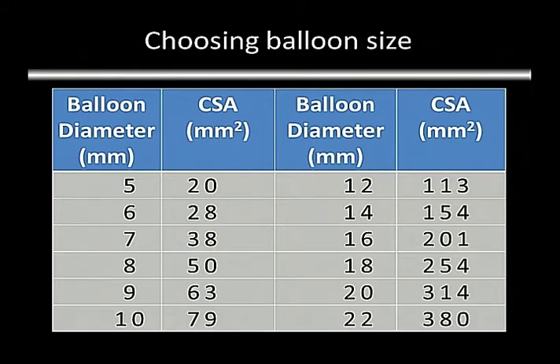Underdilated, overdilated, had to use 3 or 4 different balloons to keep finding my endpoint. But now I'm usually pretty accurate with one balloon, and I'm confident most of the time that I've got a sufficient amount of distension without over distension. Now that's my own judgment about what over distension versus under distension are. But my general rule is to go with a balloon that's approximately 50 to 80% greater in cross-sectional area than the measurement of the vein that I'm dilating.